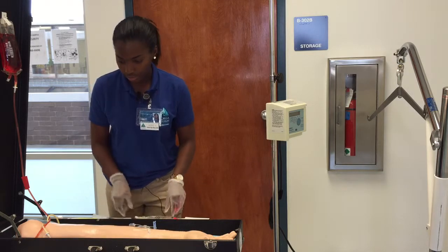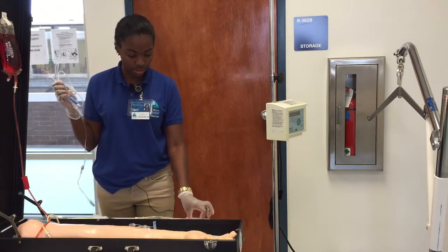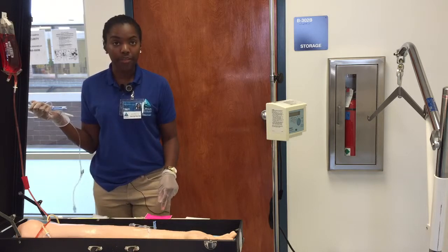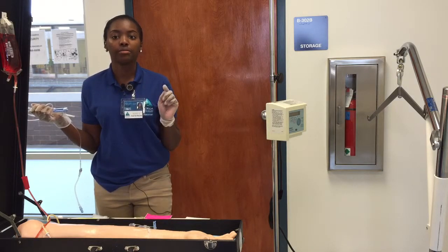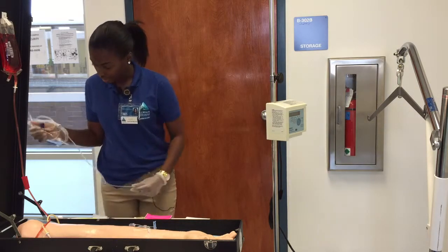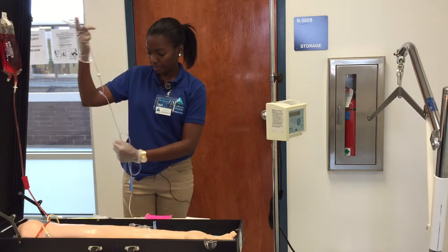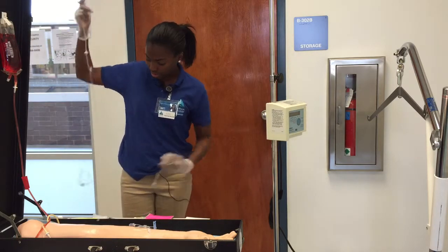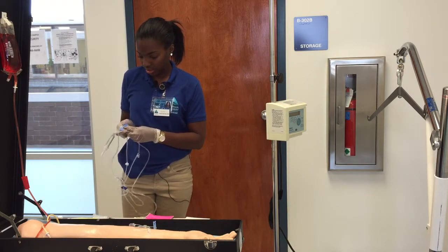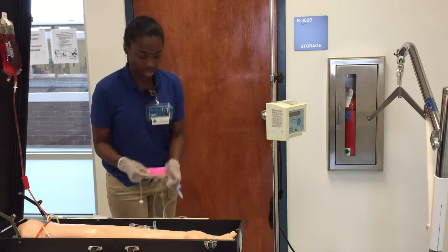Okay, and then I would attach my tubing. Before I do that, I will label my medication bag with the name of the patient, the time of administration, the dosage, and my initials. And then I would attach my new tubing and make sure the line is closed before I attach it to the medication. Okay. So my label is attached.